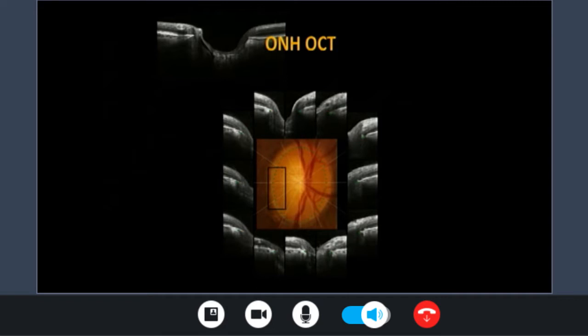Look at this blood vessel in the optic nerve head. It seems that it's hanging over something. The structure which is hanging over it is the invisible extension of the Bruch's membrane. Now remember that axons cannot penetrate the Bruch's membrane. They need to pass until they reach the edge of the Bruch's membrane, then they will go through the neural canal.